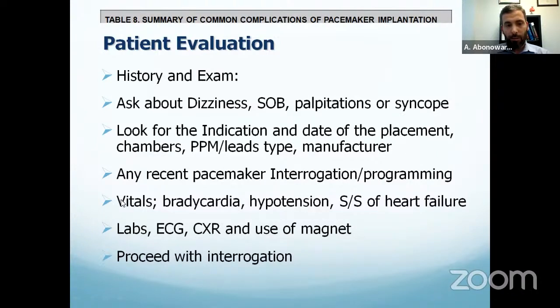And check the vitals of the patient, obviously, especially if there are any issues with the heart, like bradycardia, hypotension, heart failure symptoms. And then you take basic labs, ECG, chest X-ray, very important. These three things: basic blood work, ECG, and chest X-ray for the patient with symptoms after pacemaker, especially recent pacemaker implantation. If you think it's related to the pacemaker, do an ECG and chest X-ray, routine blood work, and you deal with the patient the usual way.